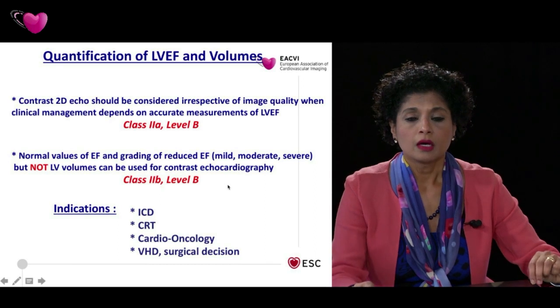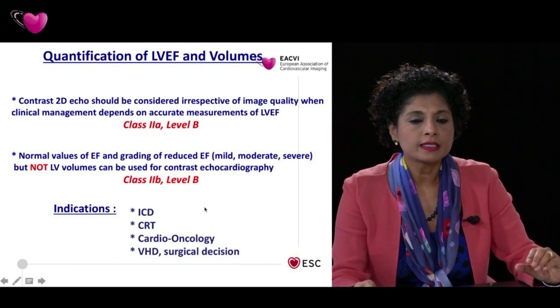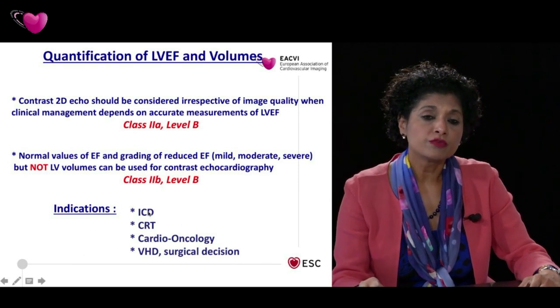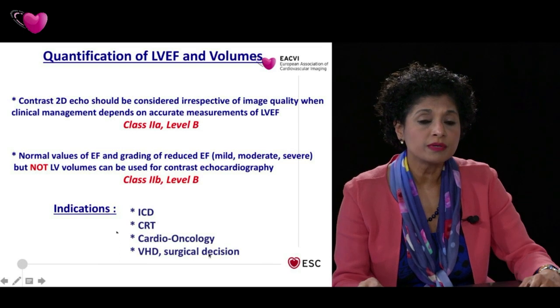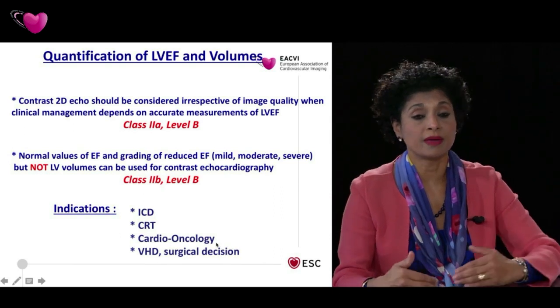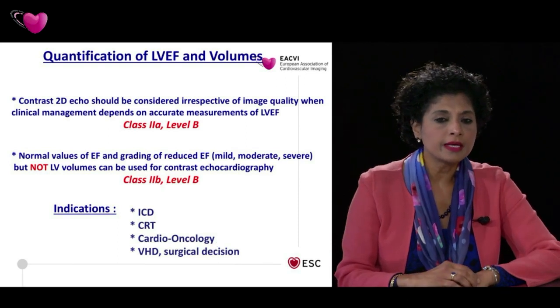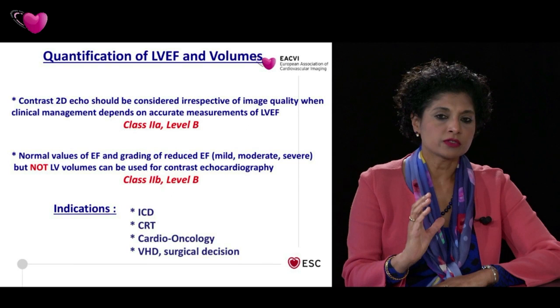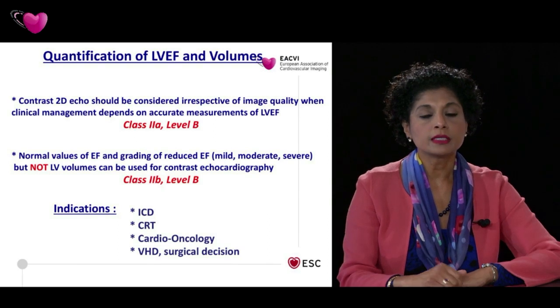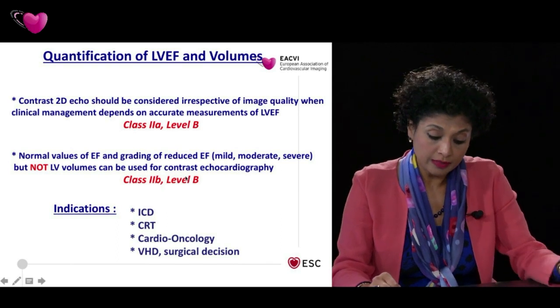Now, accurate quantification of volumes and the ejection fraction. The indications for that are obviously where it is important for clinical management, and the indications are listed here. Before ICD implantations, in CRT, cardio-oncology patients, and also in valvular heart disease, where surgical decision is dependent on accurate assessment of the ejection fraction. Now, an important point to remember here is that even though the ejection fraction may correspond in non-contrast, contrast, and perhaps another modality that you might be using, the LV volumes do not agree in contrast versus non-contrast echoes for the reasons we've mentioned before.